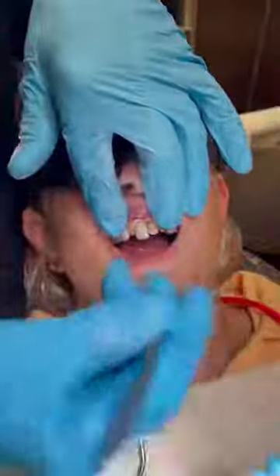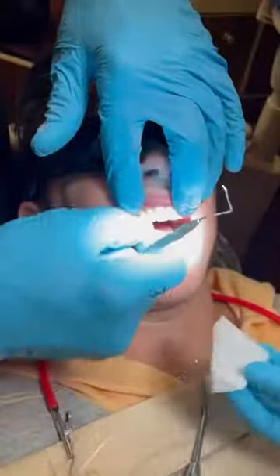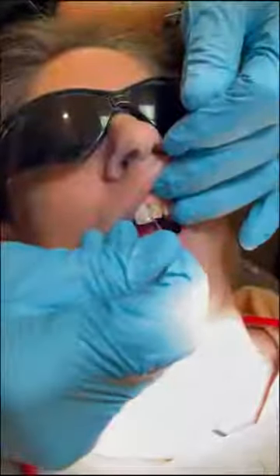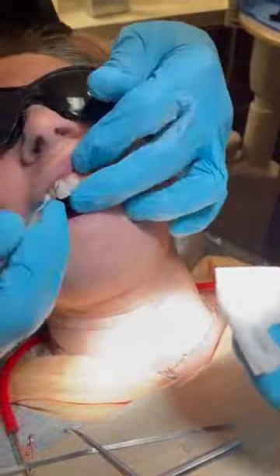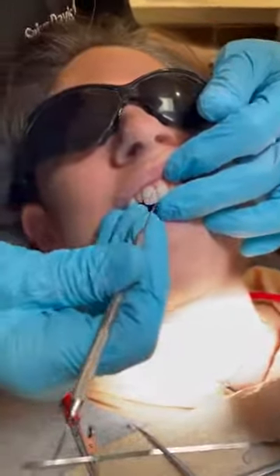And then Nicole will get to look at them here in a few minutes, but we have to push each one on there carefully, hold it, cure it with the light, and then we do that with all of those. We clean off the excess. And the excess is, we cure it with a light, and so then we peel off the excess. It kind of comes off like little chunks of glue or little pieces of glue, and then we shine the light and everything hardens up. And so now she has 2 of her crowns on, and we're cleaning off the excess. And then we're going to place the other 2. And then all of a sudden, voila, here's Nicole. There she is, bright-eyed and bushy-tailed, ready to go back to life.